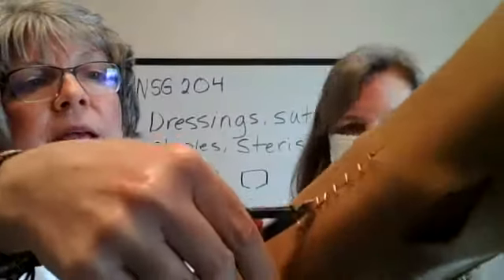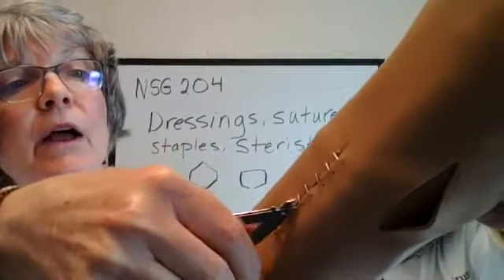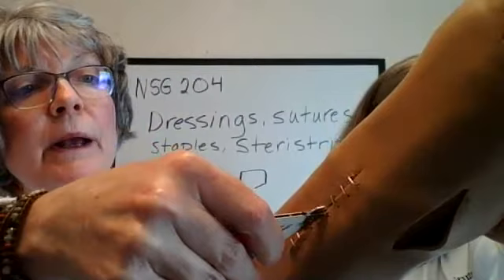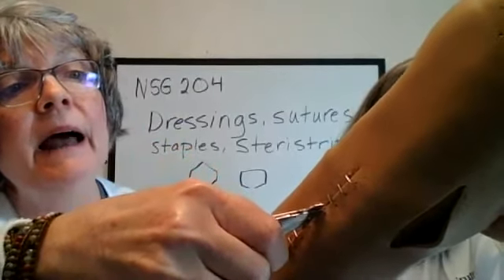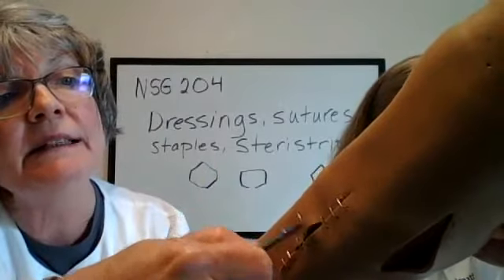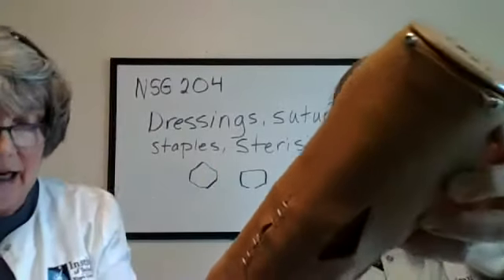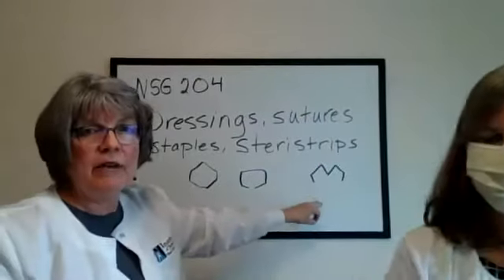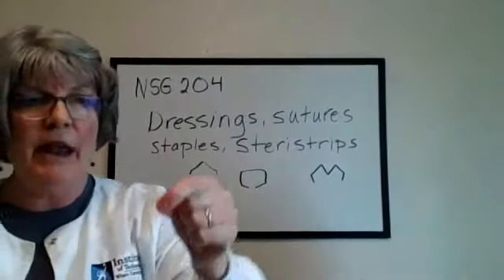So you go in under the staple. You have the two prongs on the bottom and the one prong on top. And then you pinch it. And what that does is it creates, Karen drew a picture of it here, this sort of M shape.